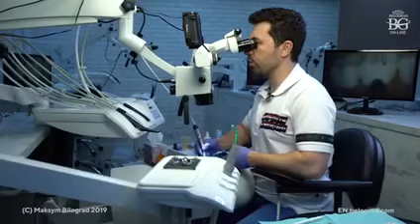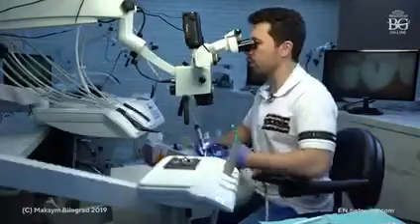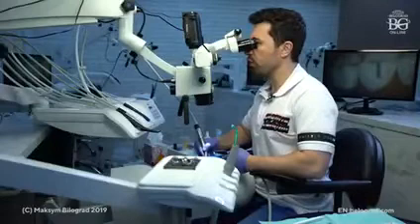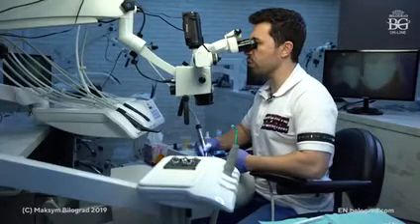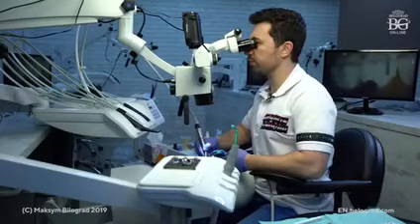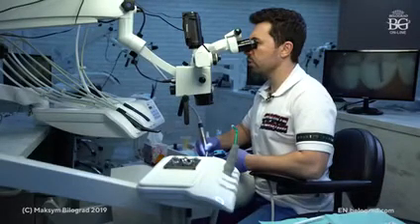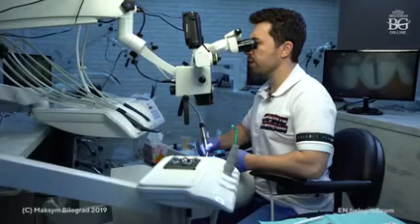Also, once you finish with the finish line, if everything is correct with your finish line, what you can do is just to smooth the buccal surface. Just make it more smooth and no pressure, just gentle movements to get your buccal surface pretty smooth.